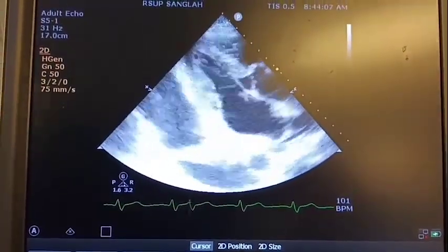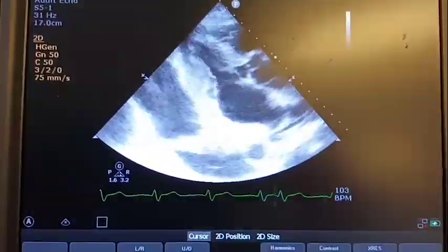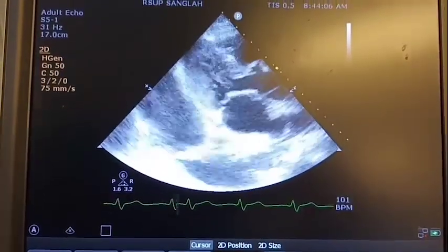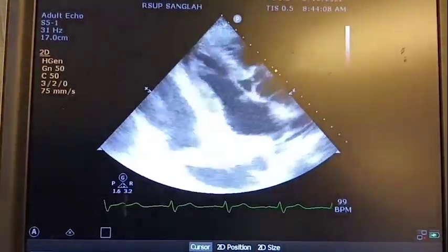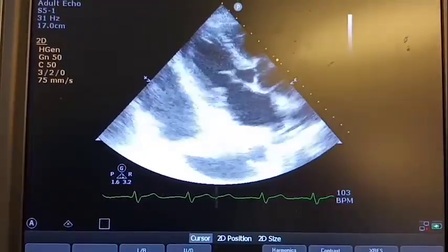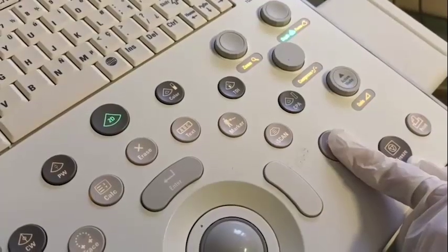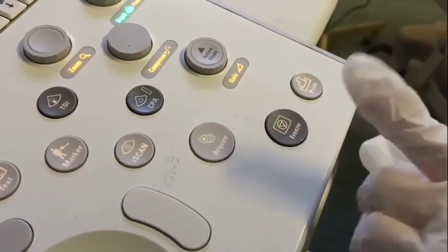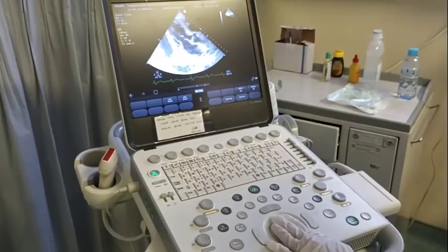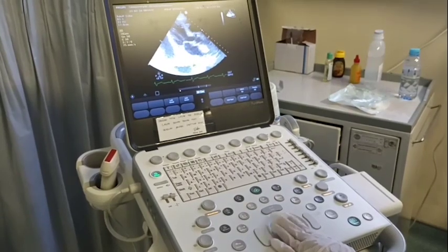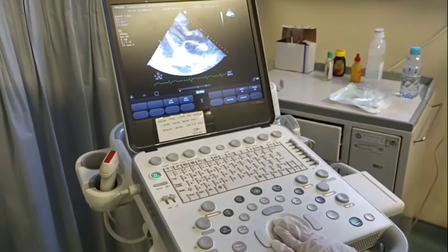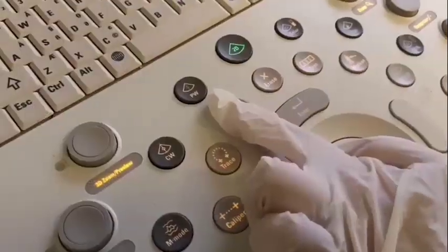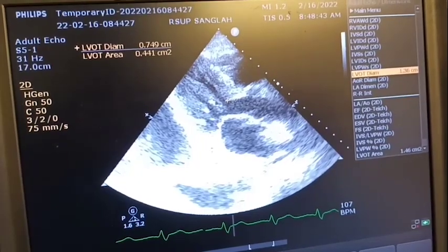On the parasternal long axis view, we will see the left atrium, mitral valve, left ventricle, aortic valve, part of the right ventricle, interventricular septum, and left ventricular posterior wall. After getting the base view, measure the left ventricular outflow tract diameter.